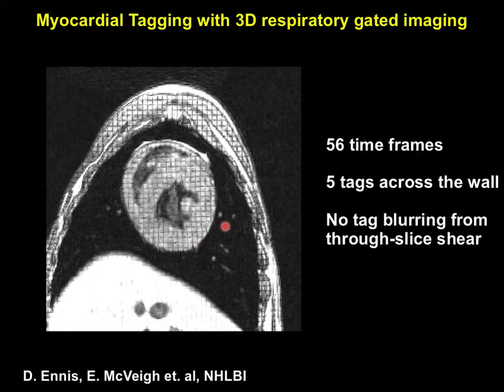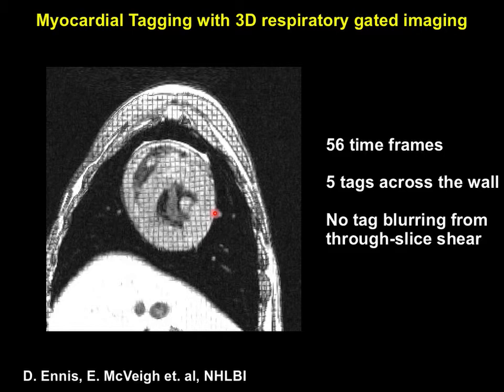So this is basically now considered the gold standard for how you measure myocardial strain with non-invasive imaging. The gold standard with invasive imaging is you put gold beads in the myocardium and you image the displacement of those gold beads under biplane high rate X-ray, getting 100 frames a second or something with a fluoroscopy system. If you're looking from two views, you can solve for the 3D trajectory of those beads. And so that's usually considered the highest resolution, both temporally and spatially, method for measuring strain.